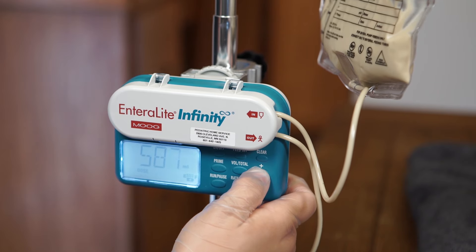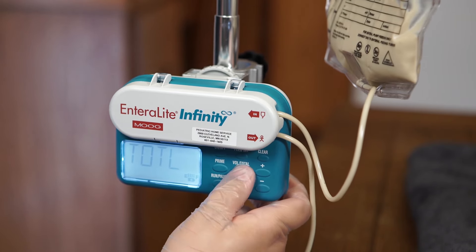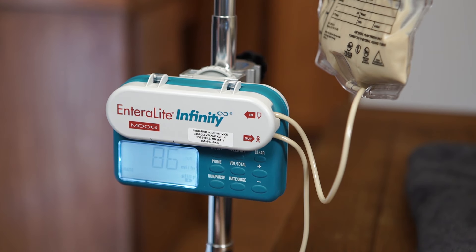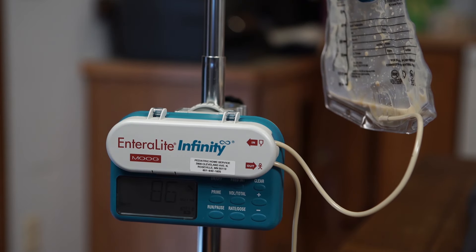If needed, clear the volume and total volume following the manufacturer's instructions. Start the food pump to begin the feeding. The pump beeps when the feeding is complete.